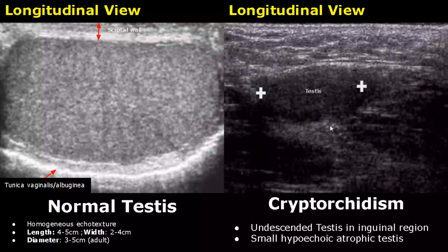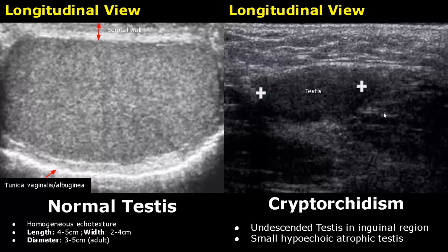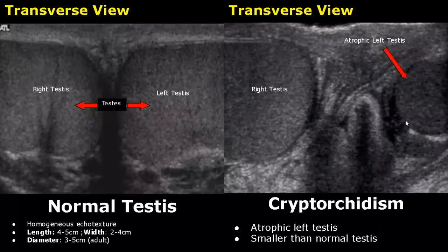Cryptorchidism refers to absence of testes and also includes undescended, ectopic, or atrophic testes. Here we see a small hypoechoic atrophic undescended testes in the inguinal region. In this transverse view we can see the atrophic left testes is smaller and more hypoechoic than the normal right testes.